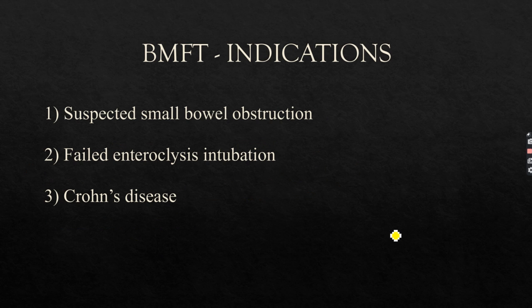Now, indications for BMFT. If we are suspecting small bowel obstruction in any patient, the patient is presenting to us with distension of abdomen with all the features of intestinal obstruction, and if we are suspecting a small bowel obstruction, a subacute intestinal obstruction, not acute obstruction, this could be one of the indications for barium meal follow through.